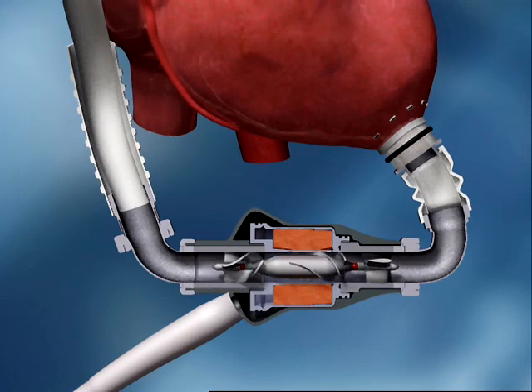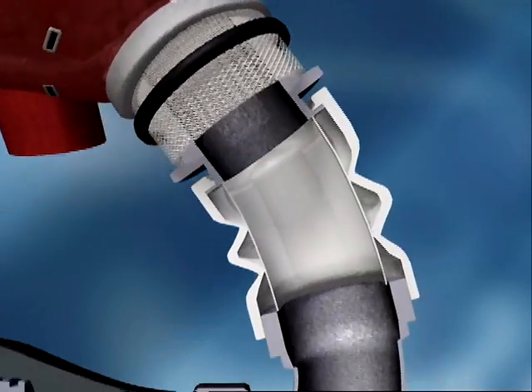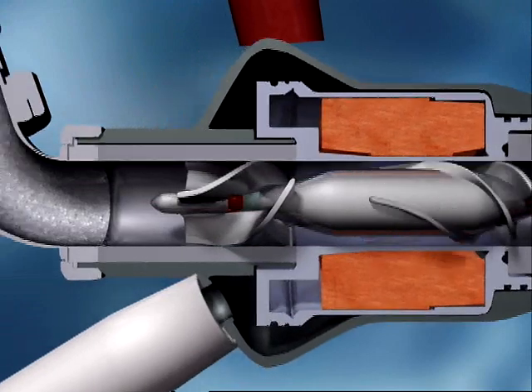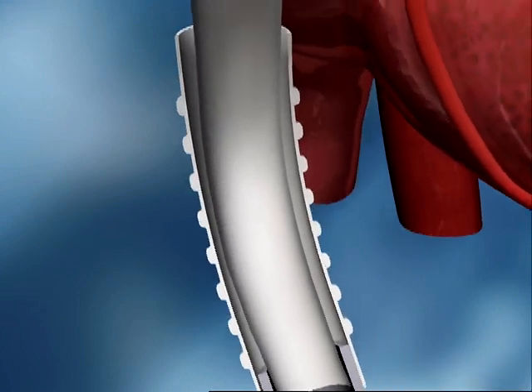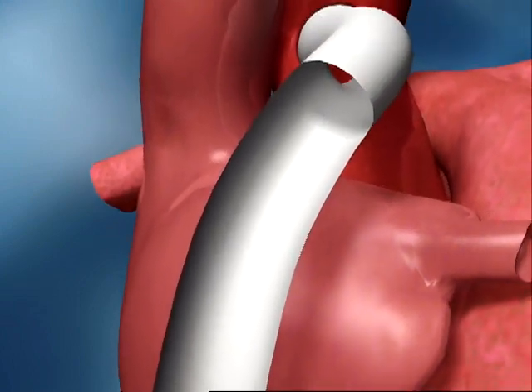The HeartMate 2 is implanted just below the heart. The flexible inflow cannula is attached to the apex of the left ventricle, and the outflow cannula is attached to the ascending aorta. The HeartMate 2 pumps blood from the weakened left ventricle to the aorta, the main artery feeding blood to the entire body.